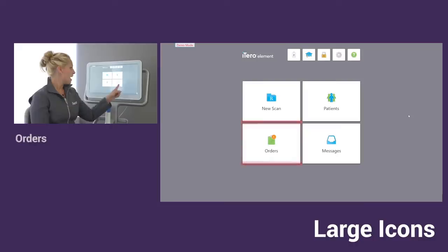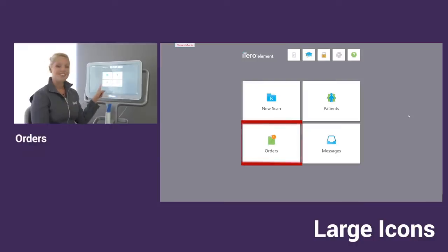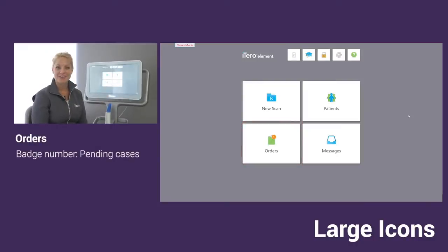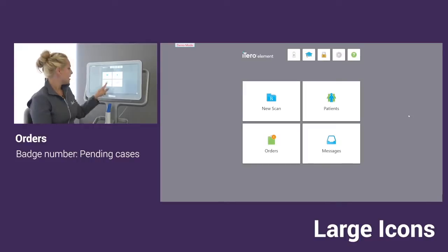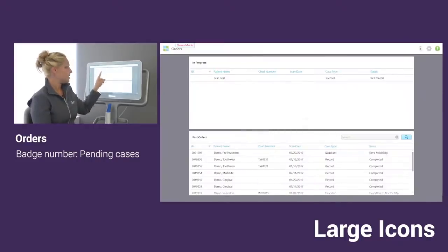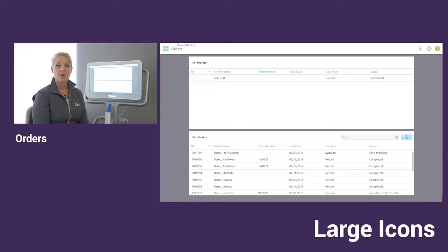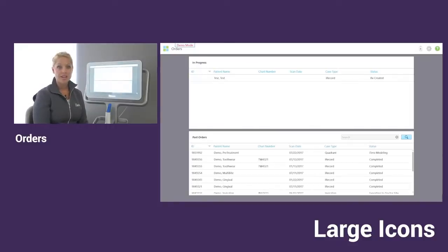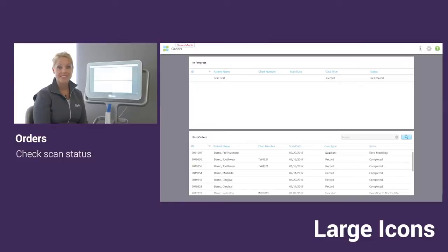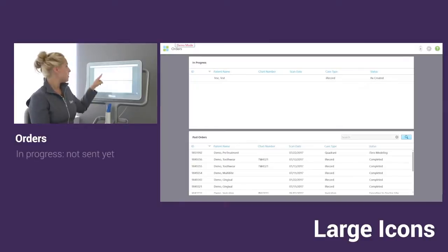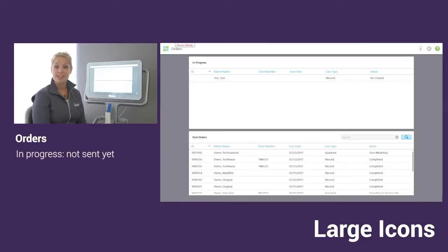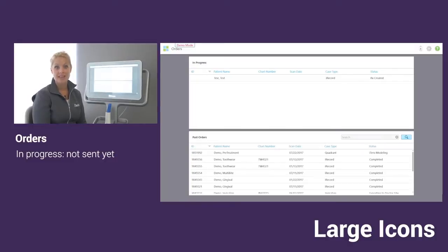Moving on, we have our orders. You're going to see that we have a number one in that orders badged icon. That's a reminder that we have one case that's still pending that we haven't sent yet. In our orders, we do come in here just to check the status of your scan, make sure that you have sent it. At the top half, all of these cases that are in progress are going to stay there literally forever until you delete it or send the scan.